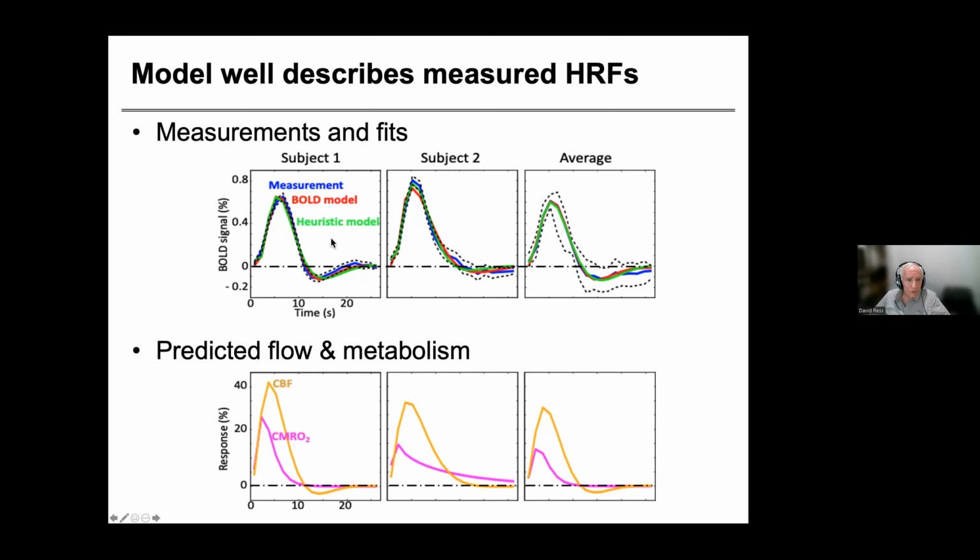And you'll see that the SAST evokes a fairly stereotypical amplitude pattern. There's strong signals in visual cortex here and here, strong signals in auditory regions, and also strong signals in certain portions of somatosensory cortex and attention areas. This stereotypy of the amplitude response has a mean correlation across subjects of 0.6. This shows the correlation across the 20 subjects. With a mean value of 0.6, it's kind of like a fingerprint of how a healthy brain responds to a particular task.